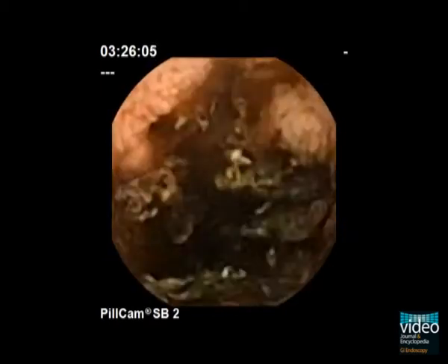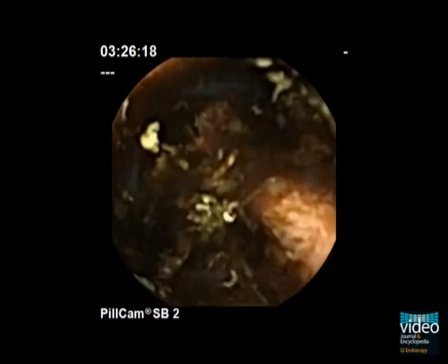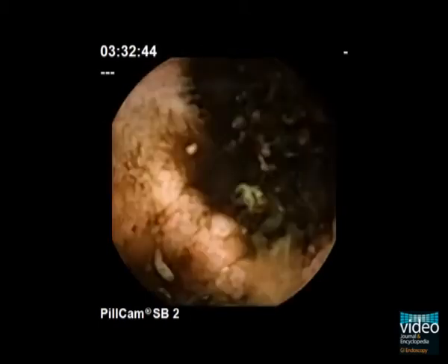The video is suggestive of some bleeding within the distal third of the small bowel. A polypoid mass is vaguely visualized.